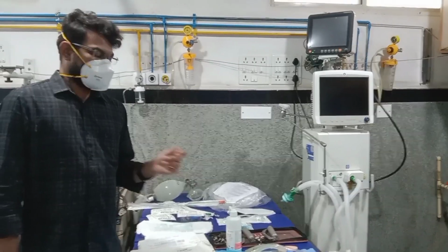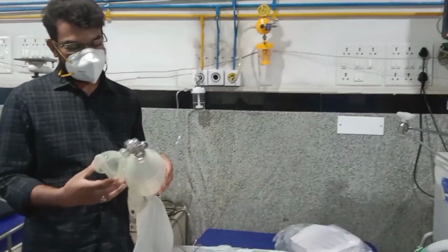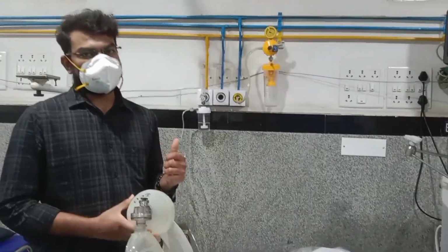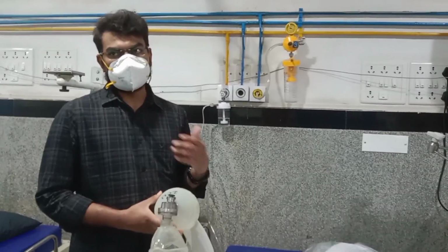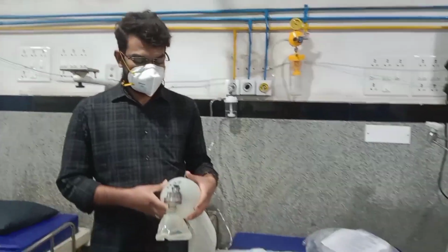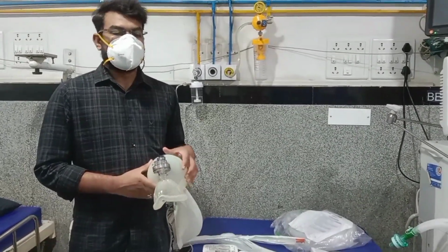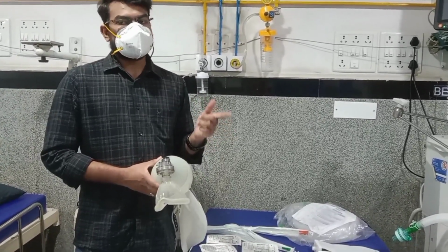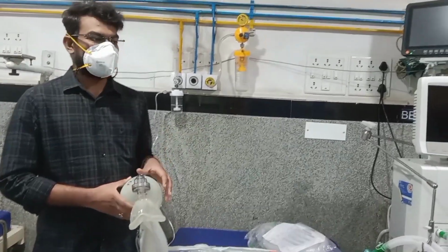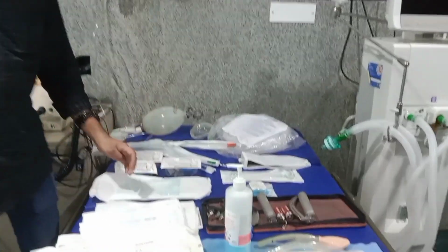Once you give the sedation medication, we should start with the pre-oxygenation. We should make sure that the patient is highly oxygenated, so that once you start intubation, we will have some time. By using the ambu, we oxygenate the patient prior to intubation, so that while the patient gets oxygenated, the patient also gets sedated at the same time. Once the patient is sedated, then we'll use the laryngoscope.